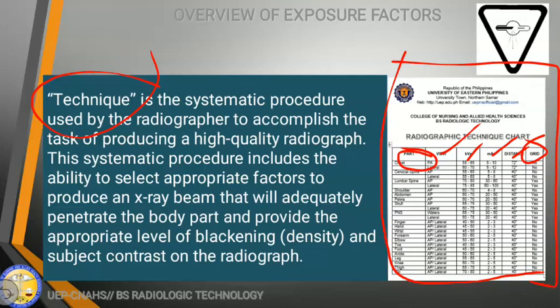Again, this is systematic because it was first tested by the students of UEP. It has been tested by my students prior to submission of these technique factor charts. But sad to say, at this moment, due to the pandemic, I won't expect you, and you definitely cannot, produce your own radiographic technique chart. Again, these technique factor charts are needed to produce a radiograph with the appropriate level of density and, of course, contrast. I guess Mr. Chan can relate to this because I know he is an artist. He probably knows density and contrast, which we will be talking about right away.